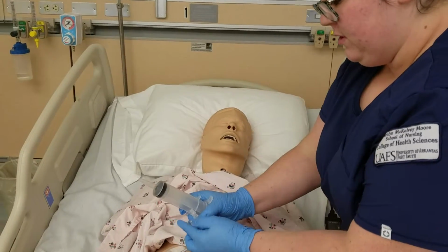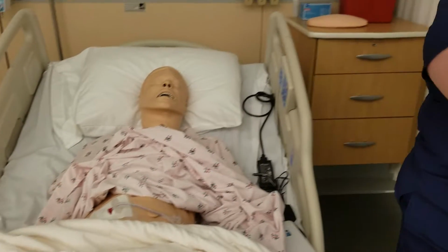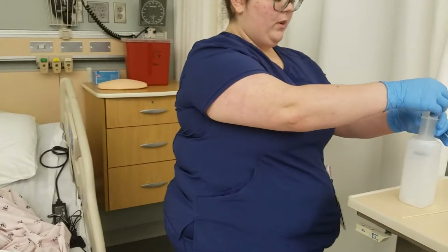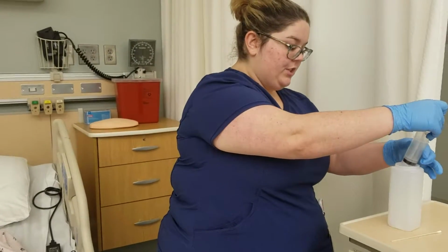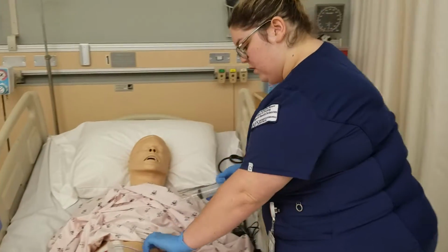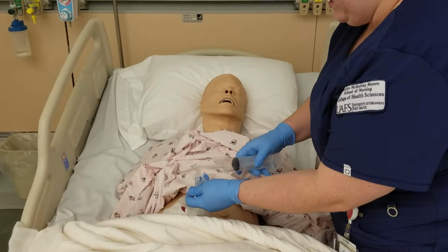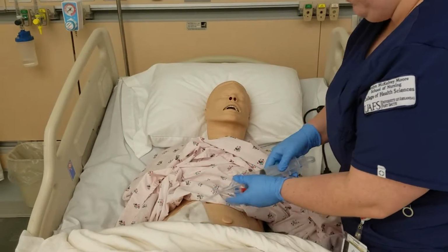I'm going to return the residual. I'm going to clamp my tube back off. And now I'm going to draw up 20 milliliters of water to flush the tube. It says you can do 15 to 30, but I'm going to do 20 milliliters of water to flush my line. You always flush before you give medications. Make sure the tube is patent.